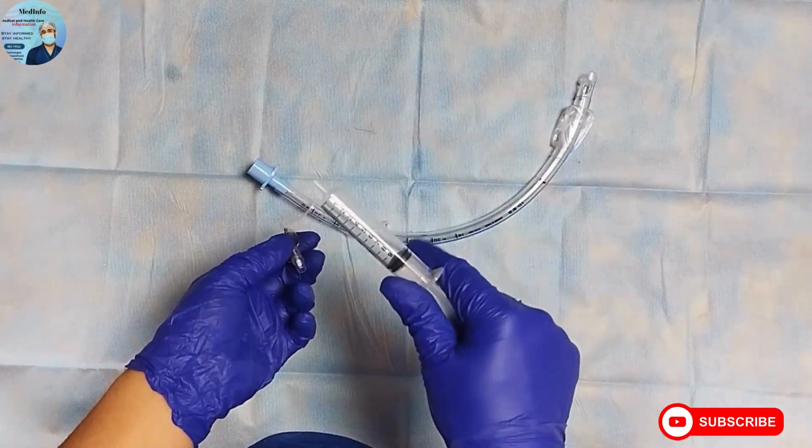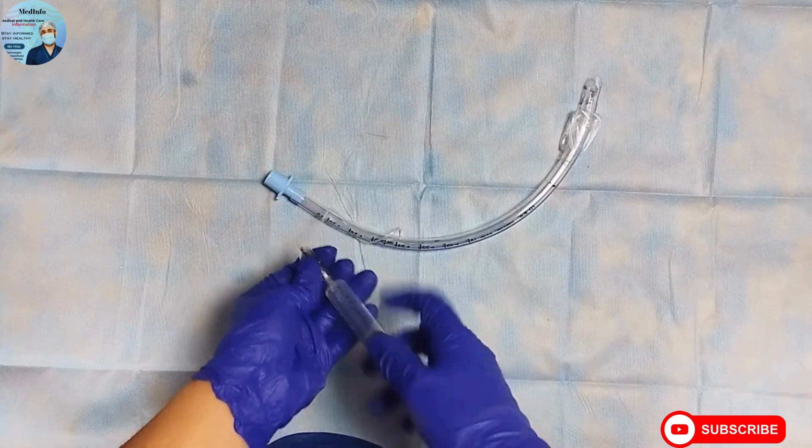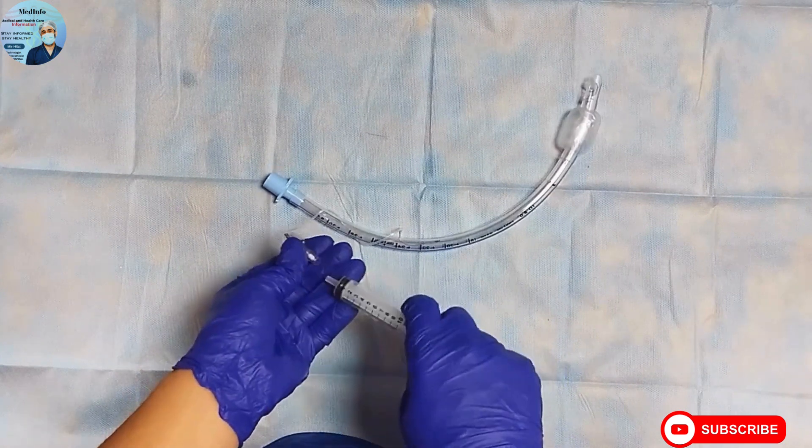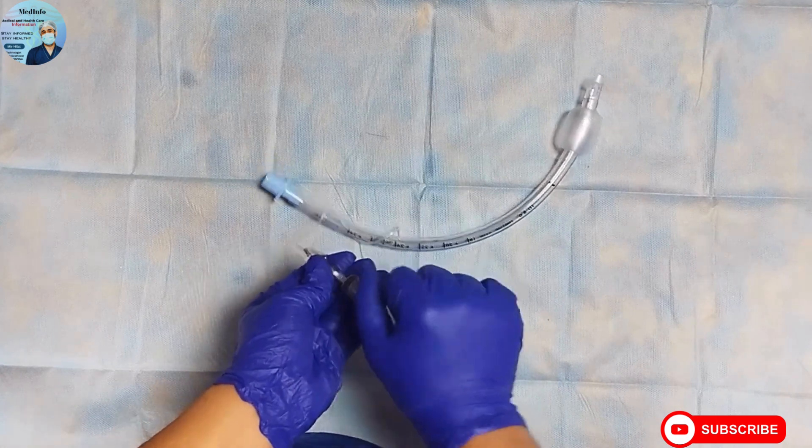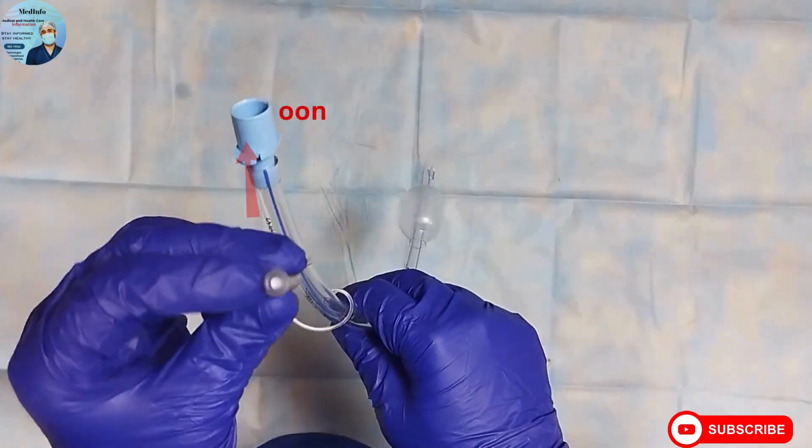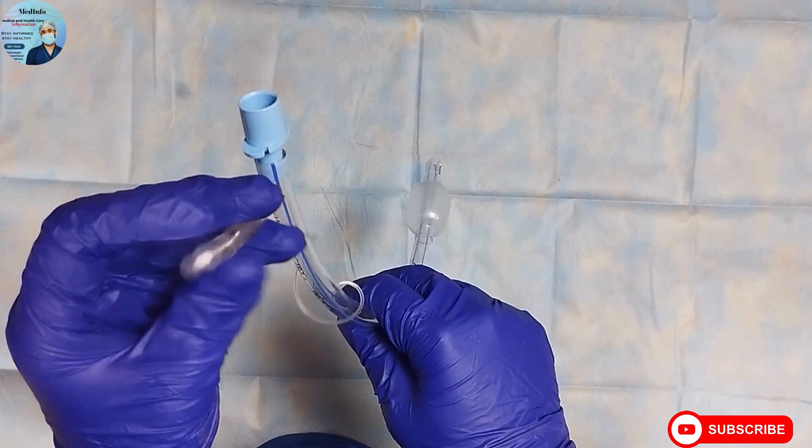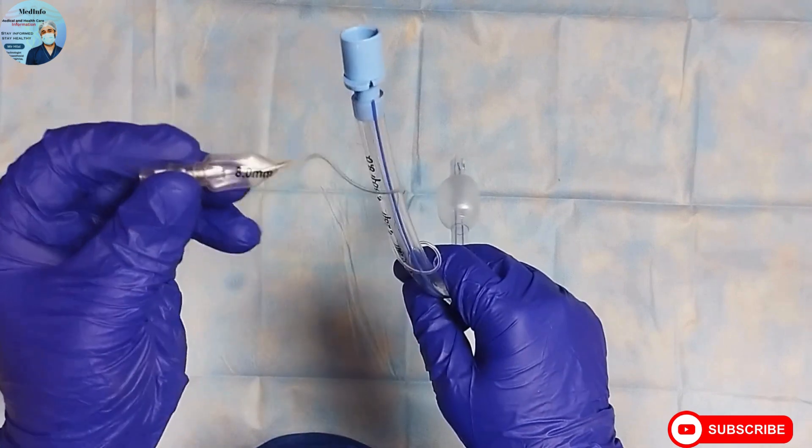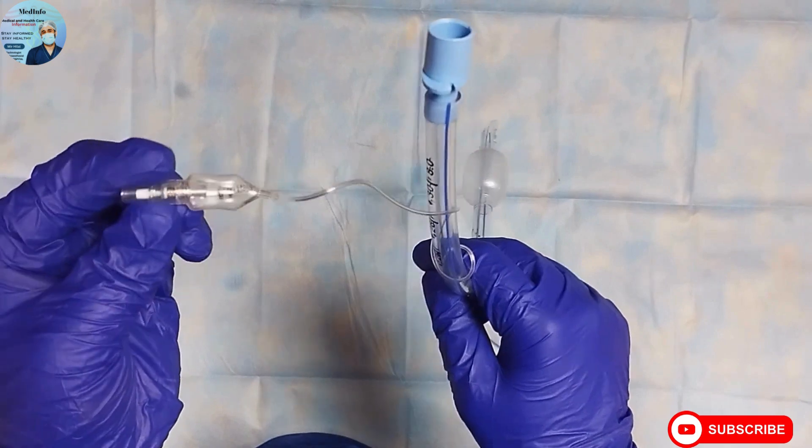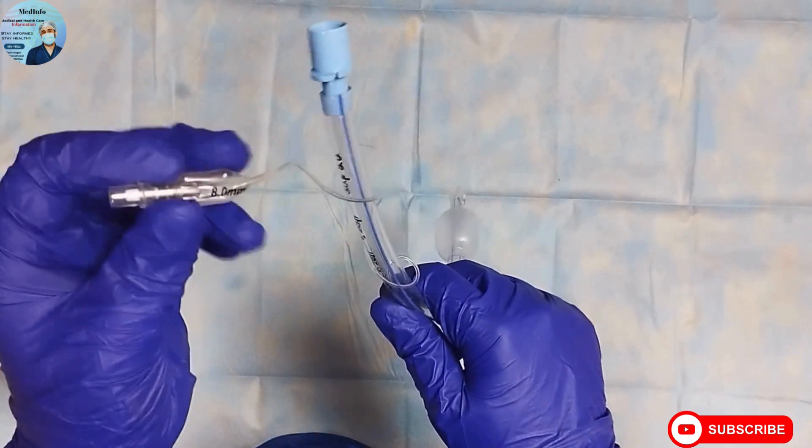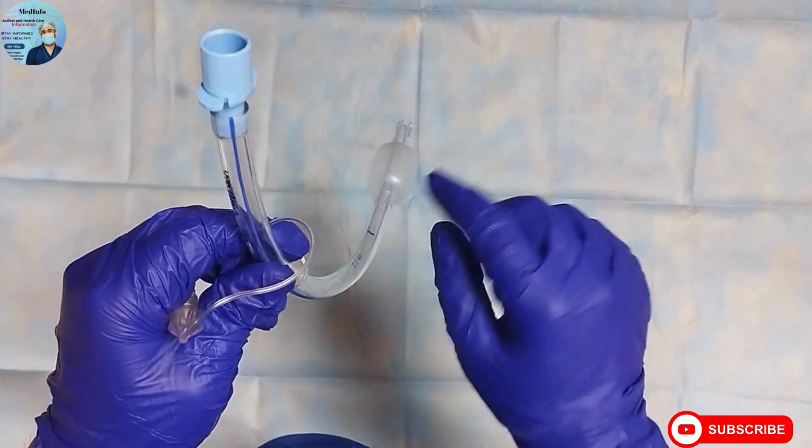This part at the proximal end of the endotracheal tube is called the pilot balloon. It has a one-way valve inside it which opens when you press it with a syringe. This way you can inflate the cuff with the required amount of air. This valve is closed when you release it, so the cuff remains inflated.